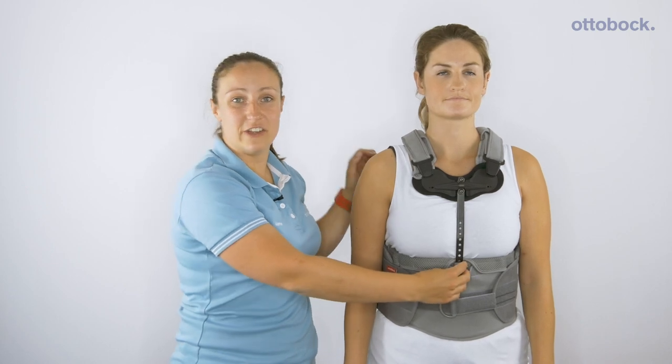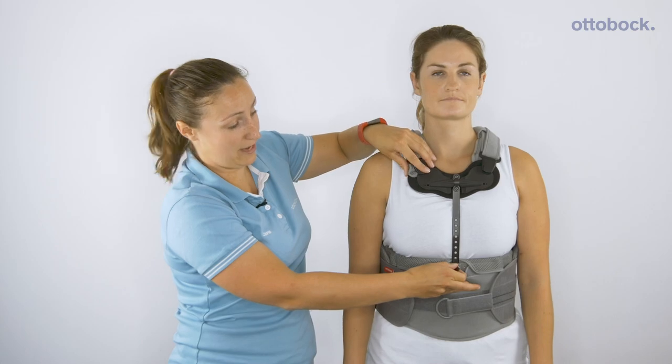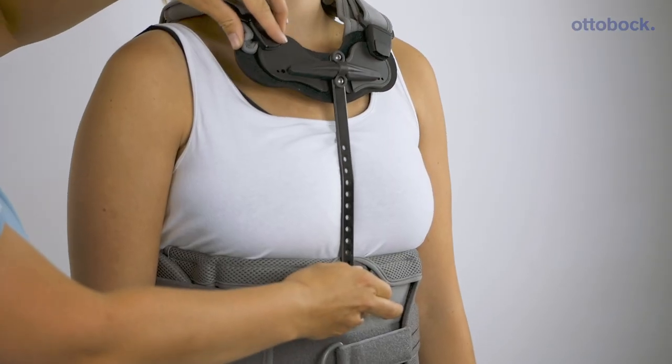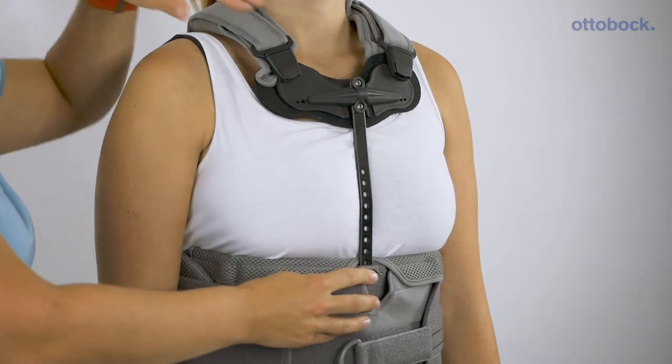The TLSO features an adjustable sternal section that's easily pulled out and moved depending on the patient, and it can be removed at a later date if required.